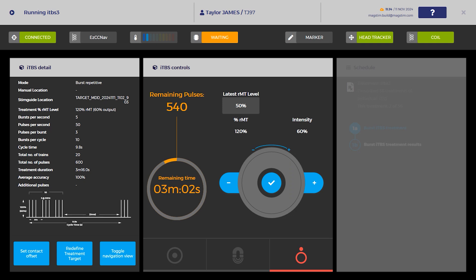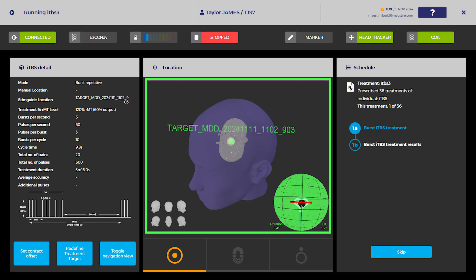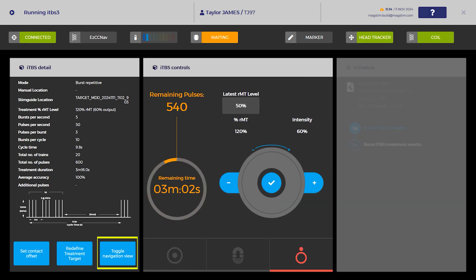The coil must remain in contact with the patient's head throughout the treatment. On the Horizon UI, a constant green border will indicate coil placement is within the specified location. Ensure that the treatment location, gimbal, and border all turn green. To toggle between the control and coil location views, press the toggle navigation button.